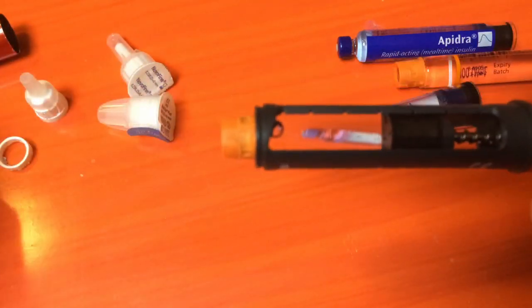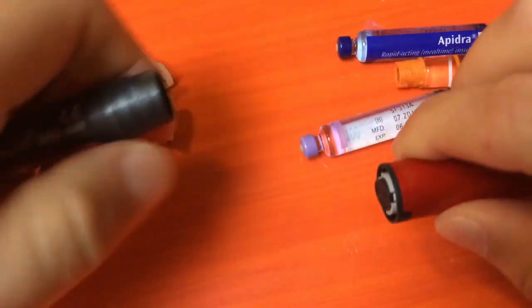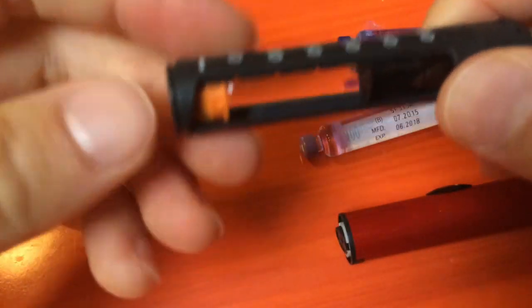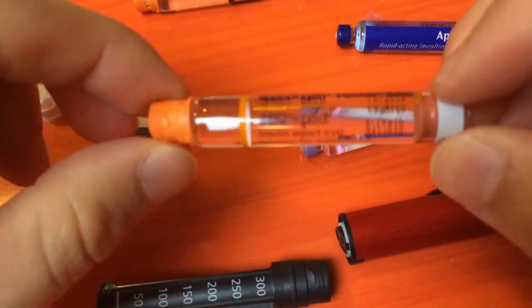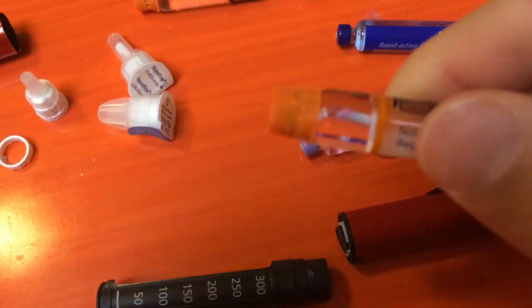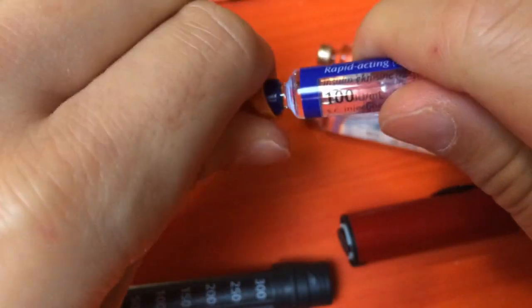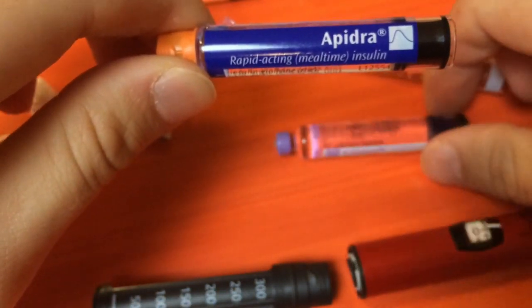The solution I came up with: first step, take off the orange cap from the NovoRapid pen fill by pulling it off. There we go. Then you push it onto the Apidra or Lantus vial, whichever you're going to be using your pen for.